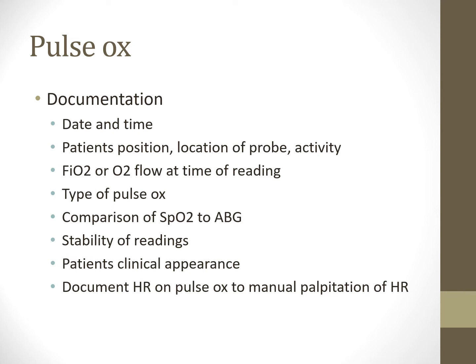Those are great things to document. Because if I document their clinical appearance was great, their blood gas was great, but their pulse ox was poor because they were on a massive amount of vasopressors, right? And so we weren't getting a lot of good perfusion to their fingers. Well, that's something I could document and then talk with the care team about a reflective sensor on the forehead. So that's something you should be looking at.